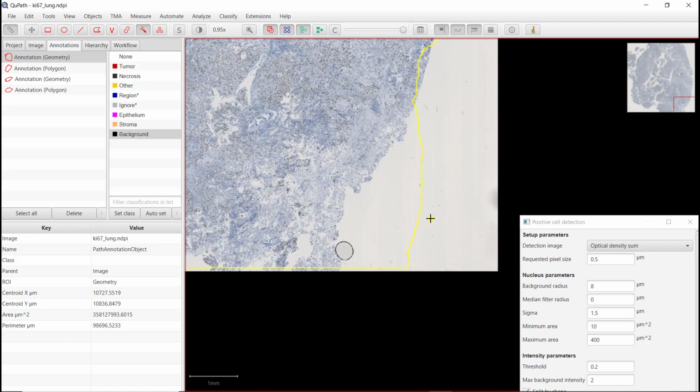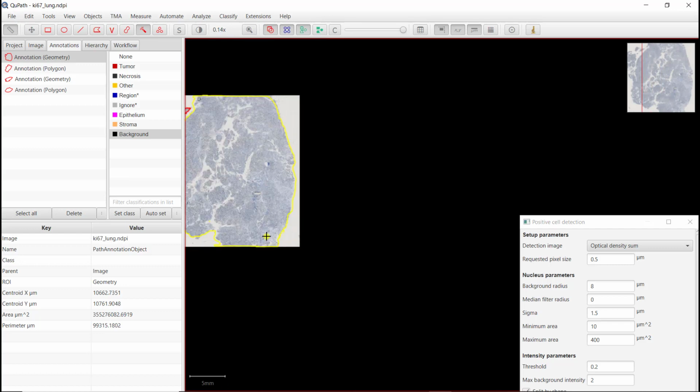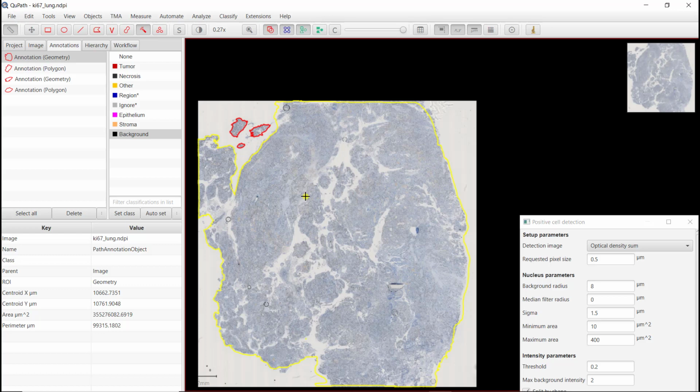Alright, and maybe just removing this. Alright, so that was not perfect, but let's say I'm okay with that. Why did I do it that way? Because now you can have the area where I'm doing the segmentation. So, maybe it would be better to remove this.